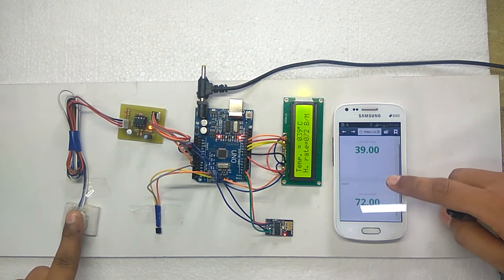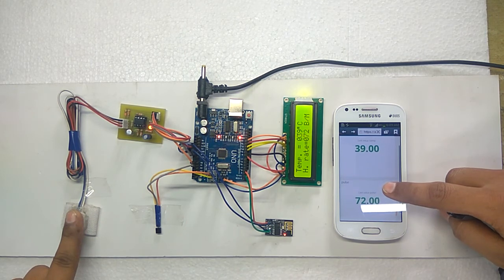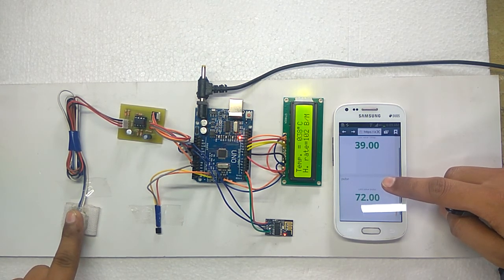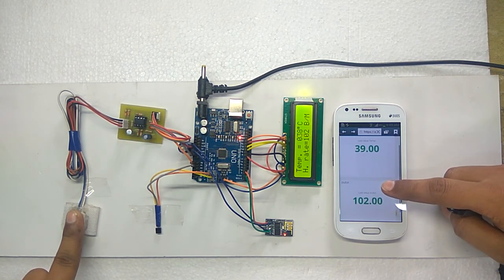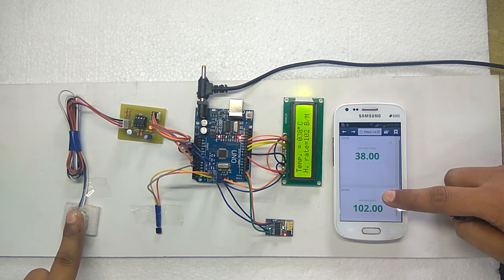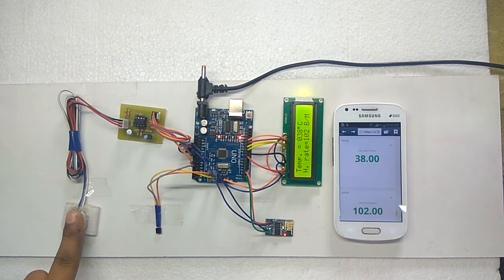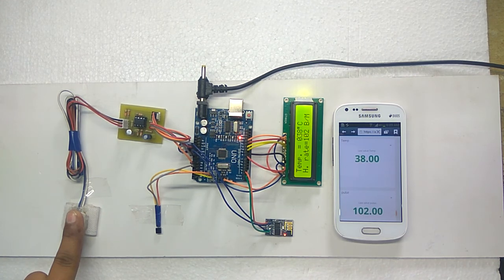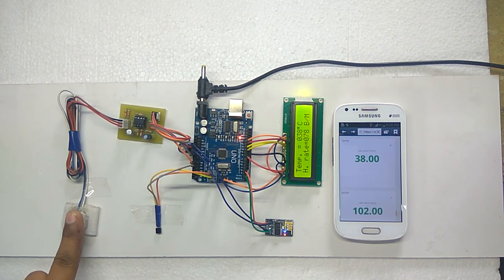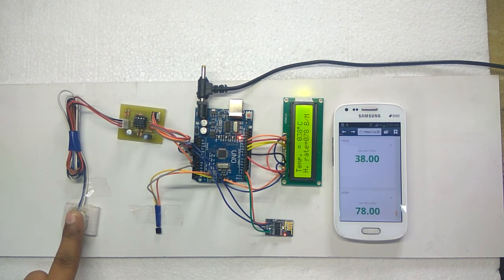Here we can see the same data will be appeared on the UBIDOTS. In this way, the patient health can be monitored from anywhere in the world using IoT. Thank you.